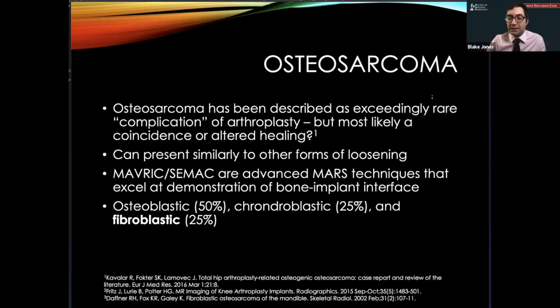Maybe you have more to add, Dr. Fayad. No, I agree with you. Pseudotumor is usually rim enhancing with a fluid center. It's more like a collection rather than soft tissue enhancement, which is what we saw here.